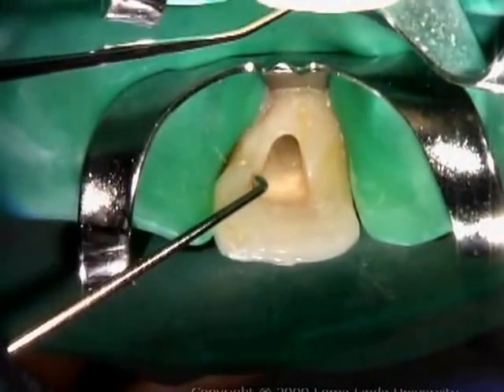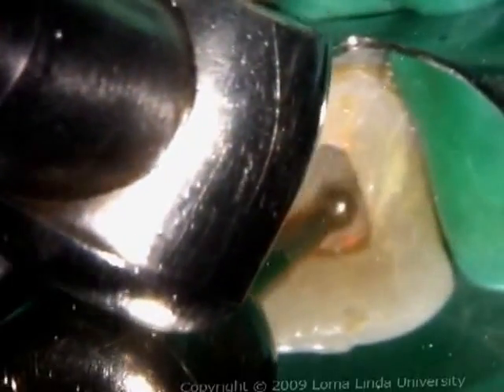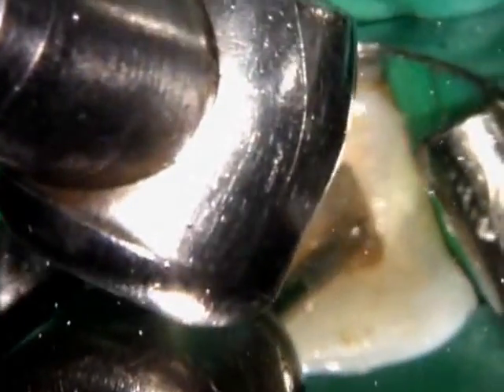Check for the presence of pulp horns. A thin layer of stained dentin is carefully removed towards the facial aspect of the chamber with a round burr. This will remove much discoloration and also opens the dentinal tubules for better penetration by the bleaching agents.